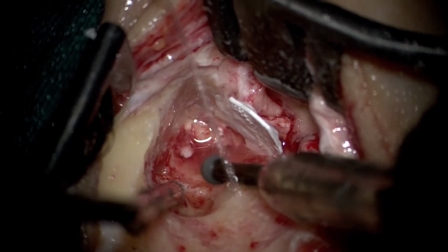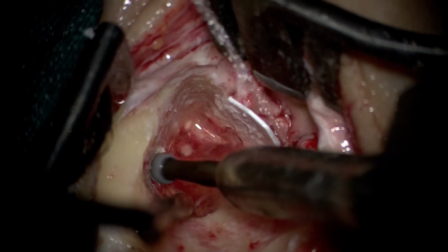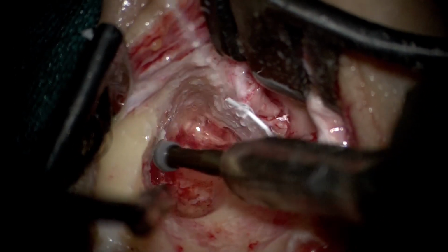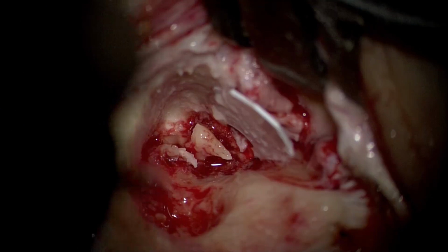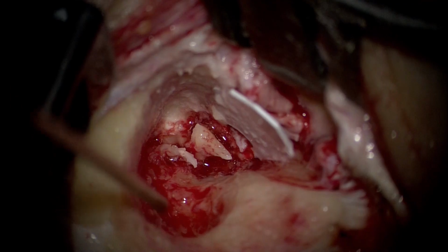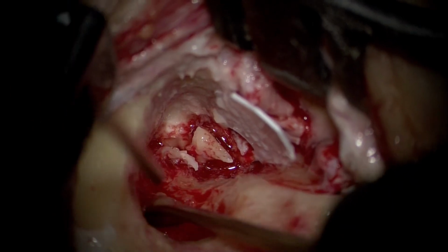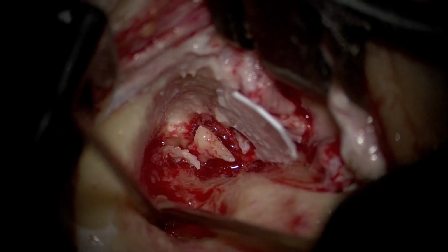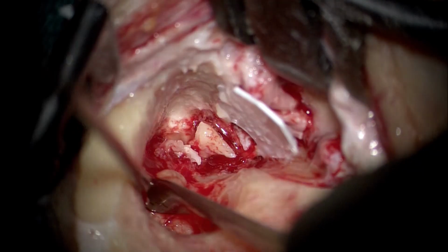As you see here, the cavity has been enlarged and the mastoid cavity has been incorporated into the atticotomy and the antrostomy. So you see now we are focusing on the posterior and the lateral wall, and you can see the diseased epithelium and the diseased mucosa, which is removed using a large blunt elevator.